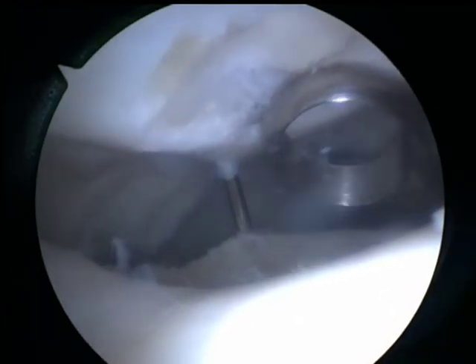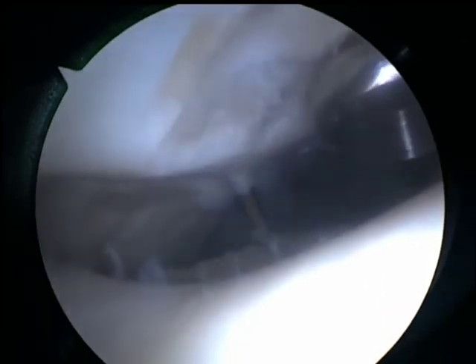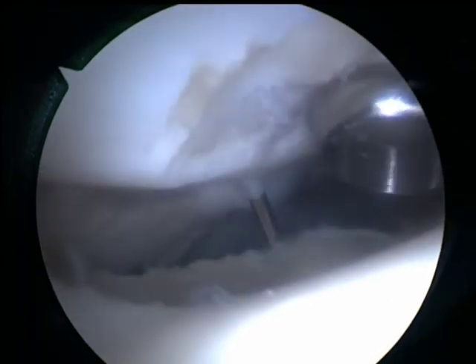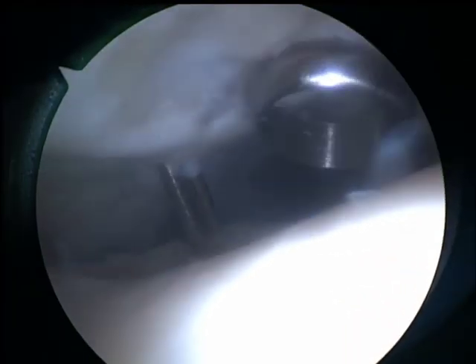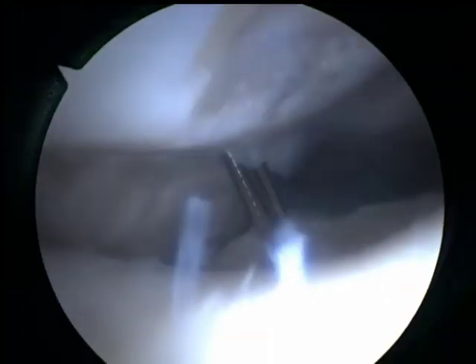This K wire is not removed because it still serves its purpose to fixate the patella. A second K wire is then inserted next to the first K wire, followed by both K wires being drilled through to the femoral condyles for the initial fixation of the patella. The improved rigidity is obvious.